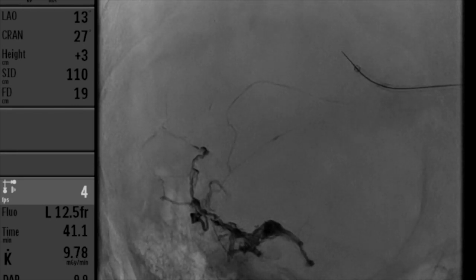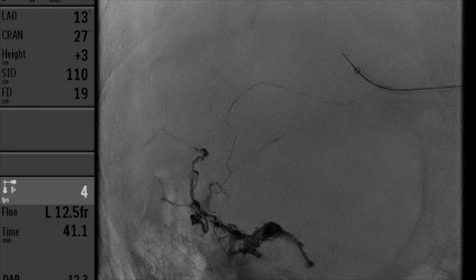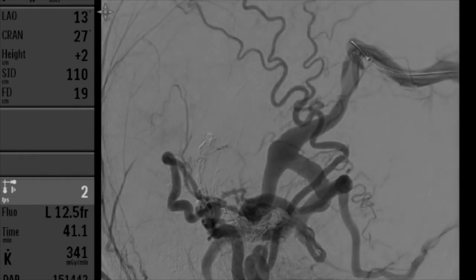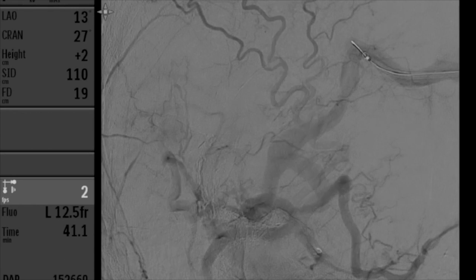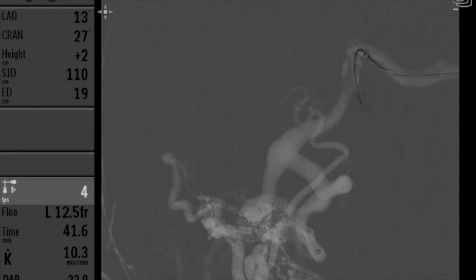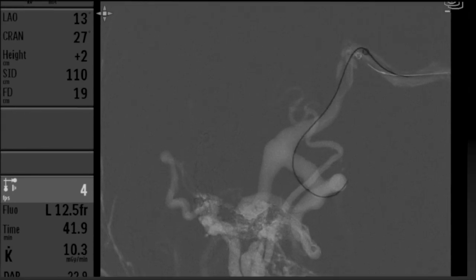Once we open the angle for better visualization, we perform another arterial angiogram to delineate the venous structures. You can observe how nicely we now see the takeoff of the multiple veins we need to navigate in order to reach the foot of the vein coming off the remaining nidus of the fistula. Here we are navigating with a 0.014 microwire followed by a 0.017-inch microcatheter.